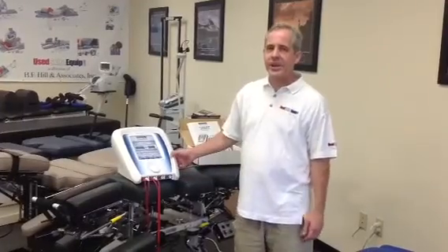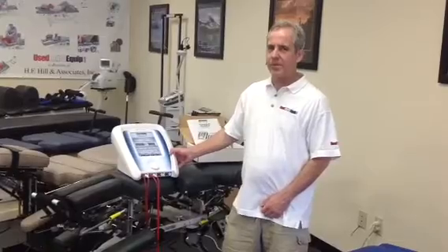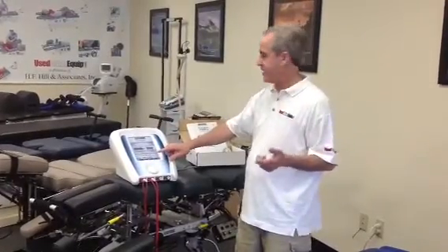We're going to shoot an educational video on how to use the Richmar ST4. The Richmar ST4 is a 4-channel stim unit that has quadripolar interferential, premod, Russian stim, high volt, and microcurrents.